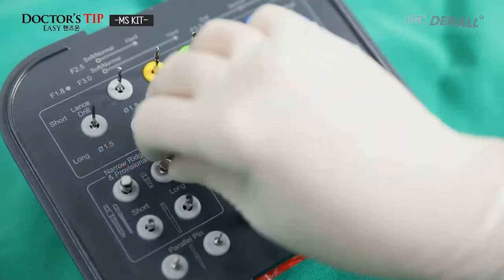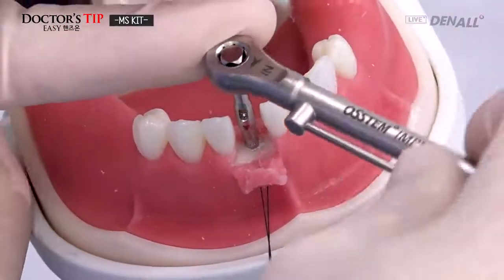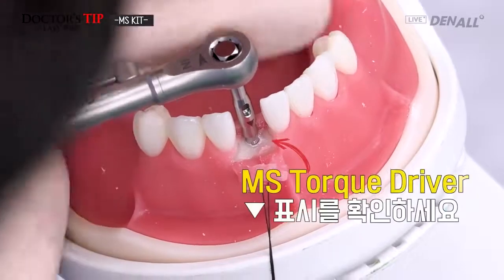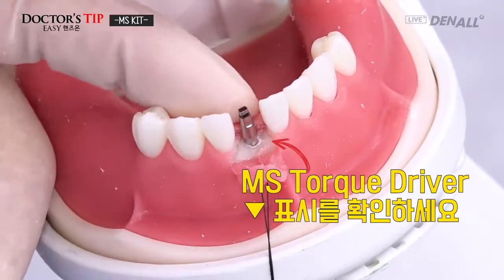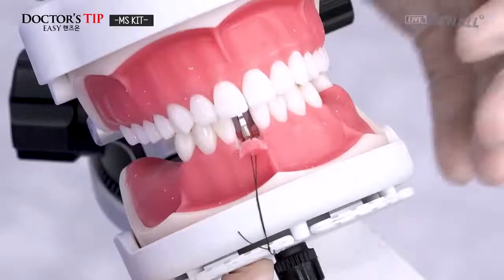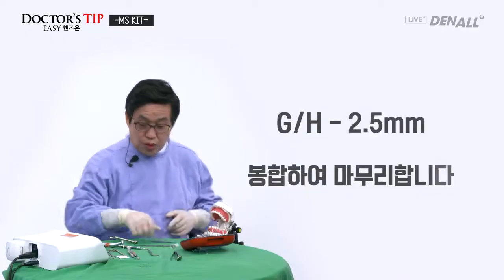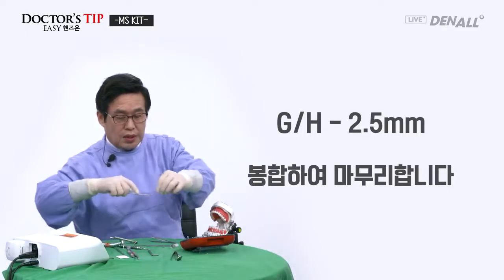And then I use this torque wrench. And you do the placement. Final positioning. Again, this triangle exists on the torque driver, so the position of the final prosthesis can be checked. And let's see whether it's aligned. Gingival height is 2.5 millimeters, and I'll do suturing. Very simple suturing.